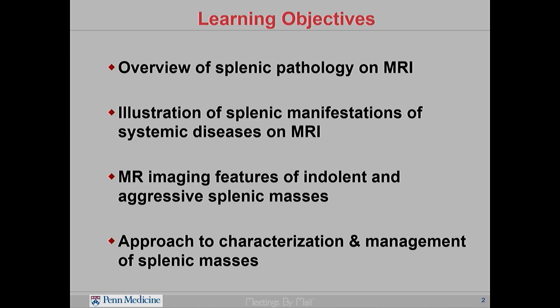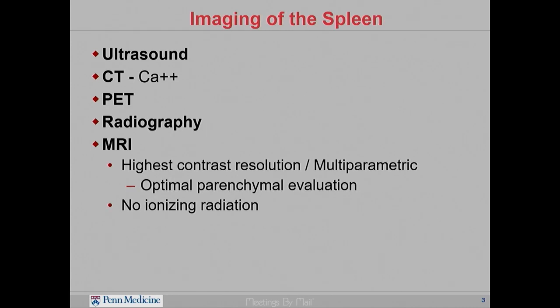We're going to talk about the splenic manifestations of systemic diseases. We'll show imaging features of indolent and aggressive splenic lesions, and we'll talk about how to sort of approach it when you come across a splenic mass.